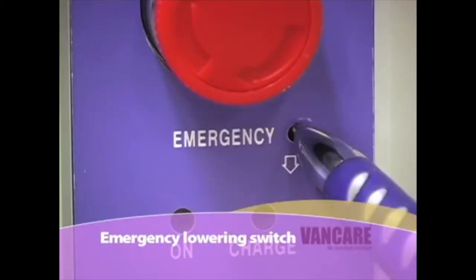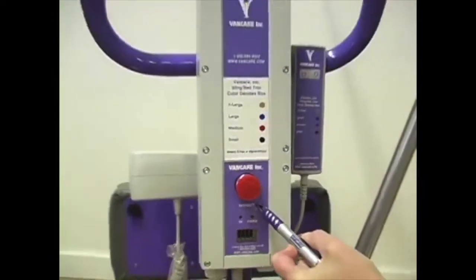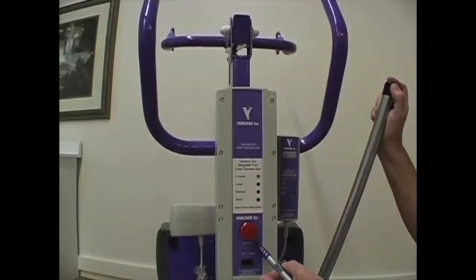Emergency lowering switch. If the pendant switch fails during a transfer, press the emergency lowering device located on the back of the battery control box with a pin or a similar item like a key. Note this switch is for emergency use only. The lift should be taken out of service until the hand pendant is repaired or replaced.